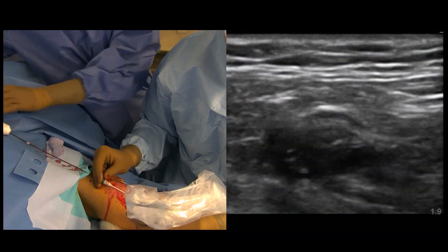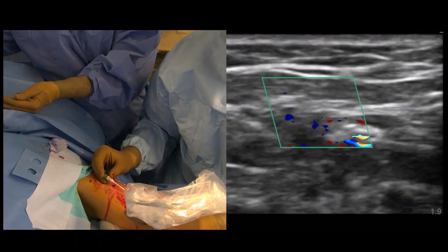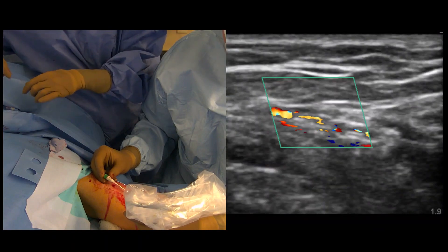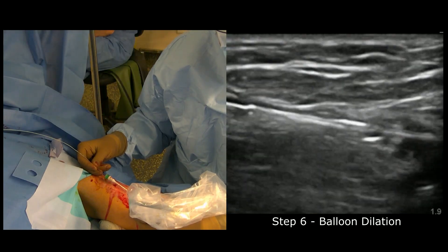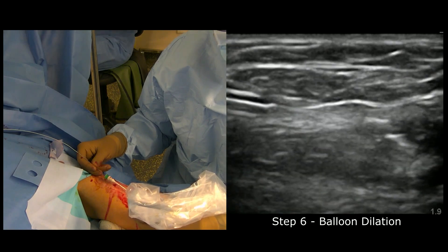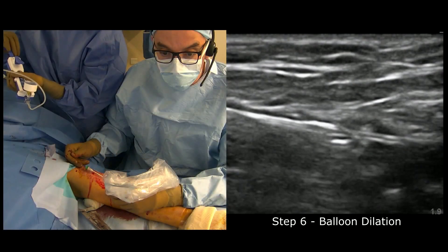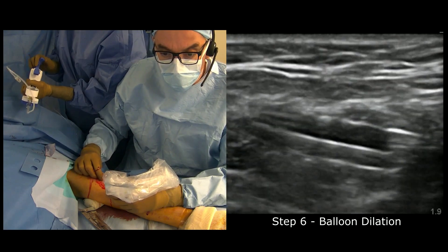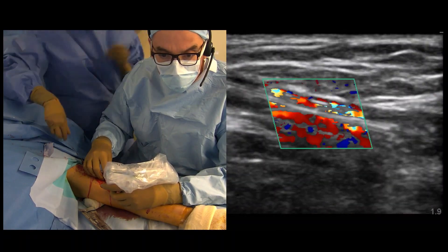At this point we're going to put the balloon in, because you can appreciate the lumen is a bit narrow and the anastomosis — due to the small profile of the device — is kind of small. We enter just a bit into the arch to be efficient with the angioplasty of the anastomosis. It's a short balloon, a 5 by 2 balloon. You can see the posterior part of the balloon is just in front of the sheath, entering the artery at this level. I'm going to take the balloon off at this point.